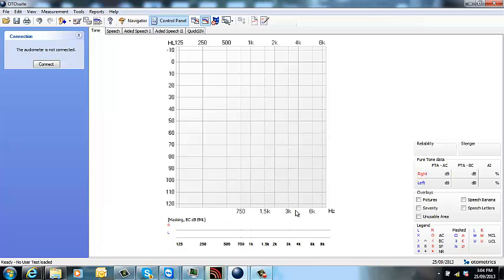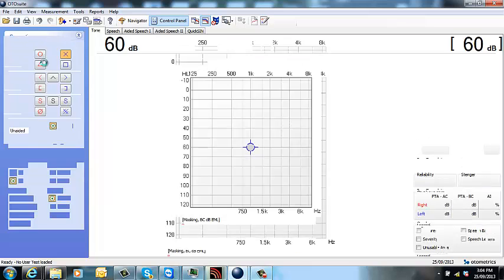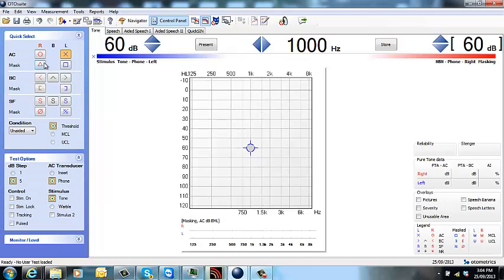Now it still says the audiometer is not connected. That's because we just need to connect it for the first time. And there you go.